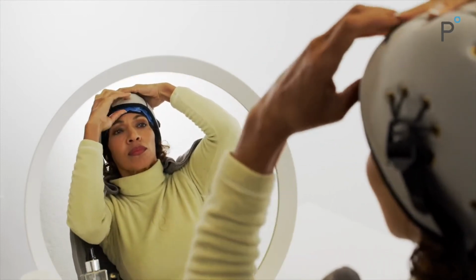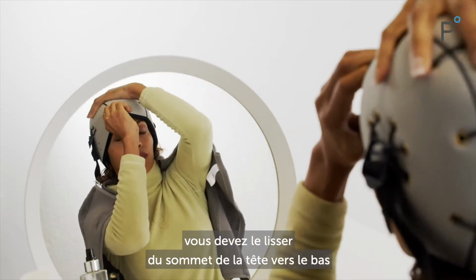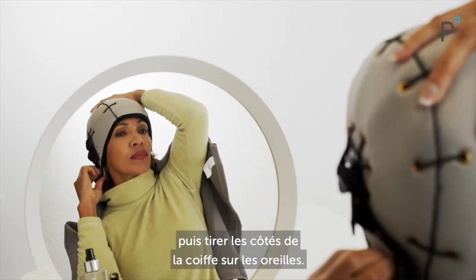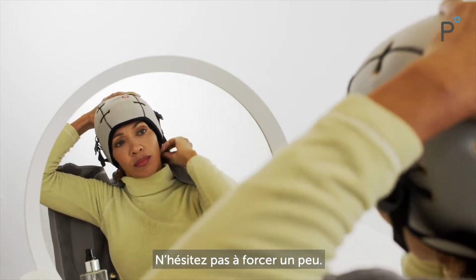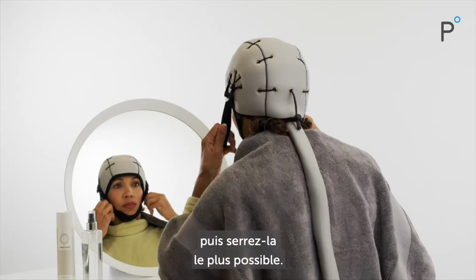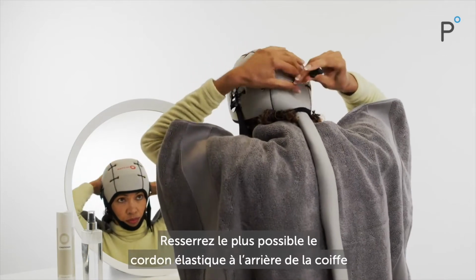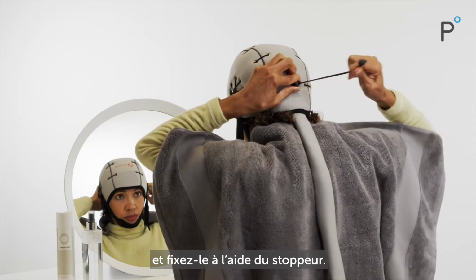No matter which option you choose to fit the cap, you now need to smooth the cap from the crown downwards, and then pull the cap cover down at the sides by your ears. Don't be afraid to use some force. Make sure the chin strap is in the right place, then tighten the strap as tightly as possible. This is only temporary. Pull the bungee cord at the back of the cover as tightly as possible and secure with the toggle.